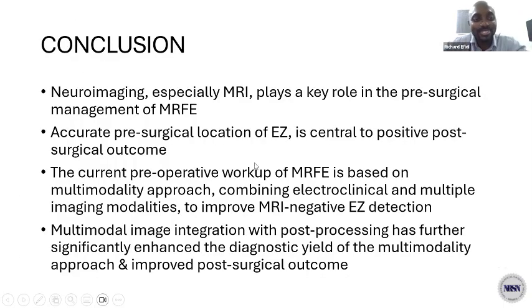So in conclusion, neuroimaging, especially MRI, plays a key role in the pre-surgical management of drug-resistant epilepsy, or medically refractory focal epilepsy. And accurate pre-surgical localization of the epileptogenic zone is critical for a positive post-surgical outcome.